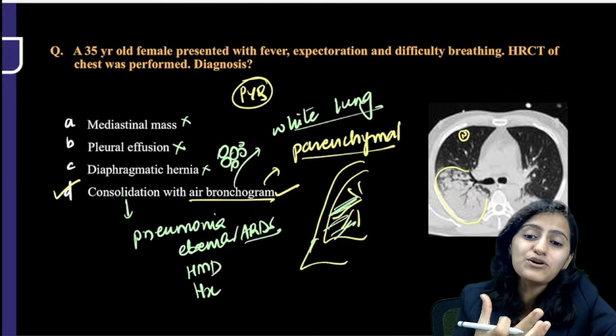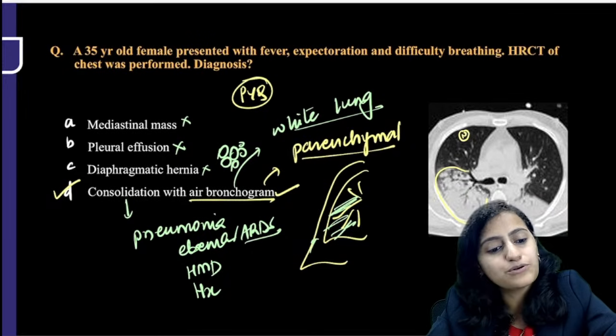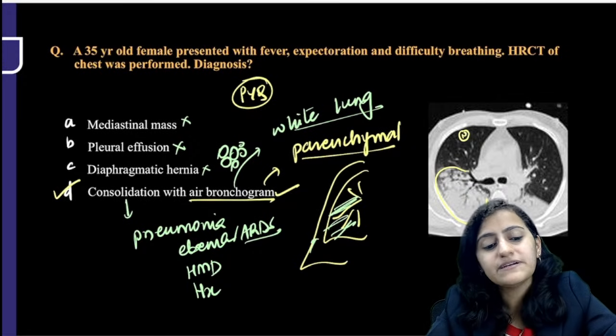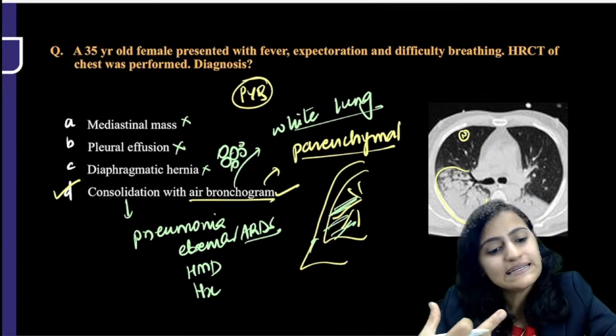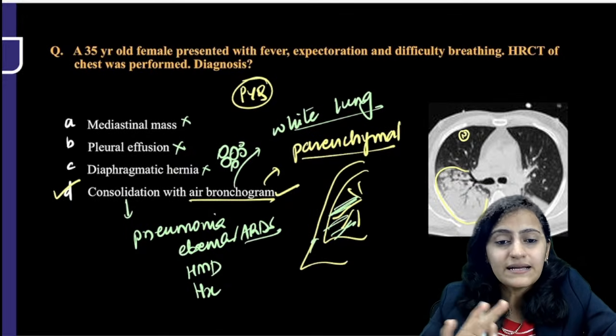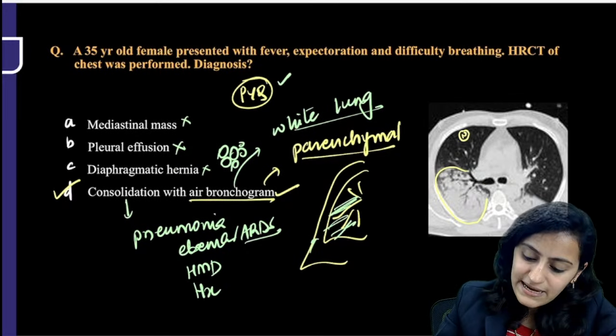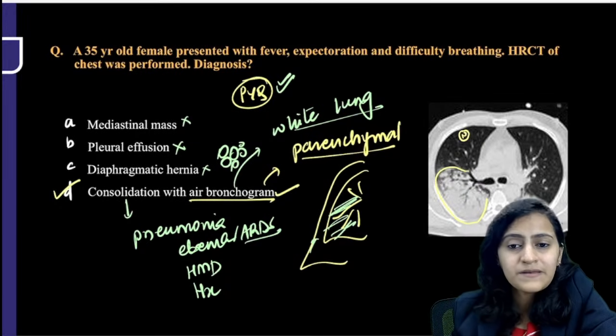It is the alveolar pathology, where the alveoli become white, that shows the air bronchogram. PAP, yes, Saurabh, pulmonary alveolar proteinosis, the lung becomes white, and even that shows the air bronchogram sign. Clear with everyone? This is a recently asked question, recently asked image, so this is very, very important.